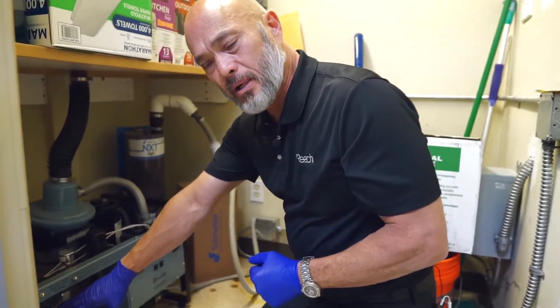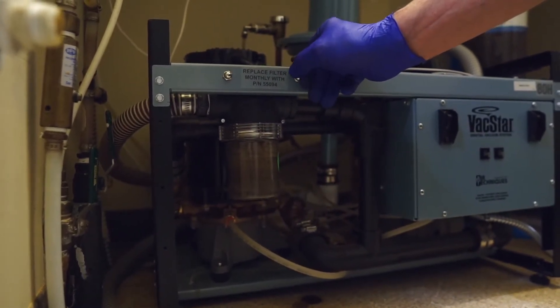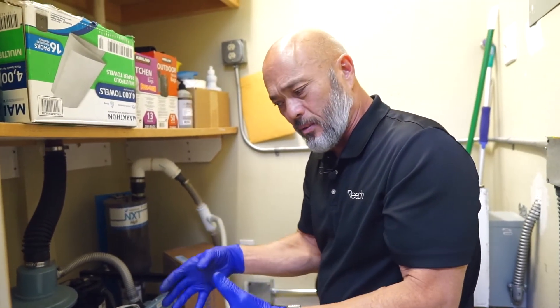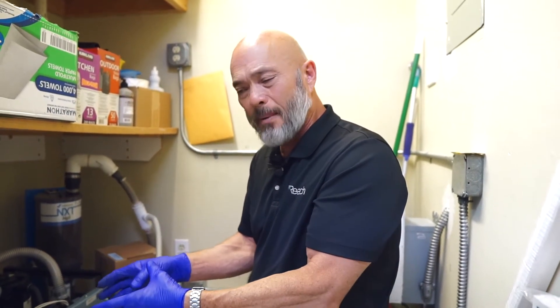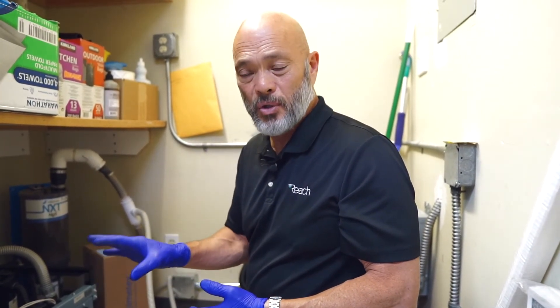Your solids trap — the little clear trap on the side — these pumps were engineered before amalgam separators were involved, and they were there to collect any solids. That technology is older because now you have the amalgam separator, which we have another Reach Tips video about. The trap on here needs to be checked on a regular basis to make sure it isn't collecting debris and to see if it needs to be changed out. You should always have one on hand or a case of them to make sure you have those available.